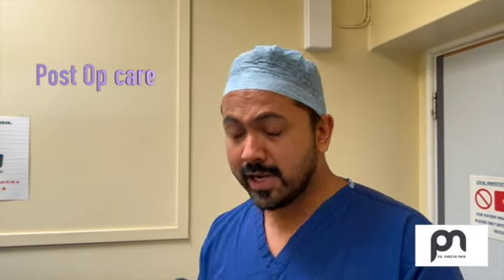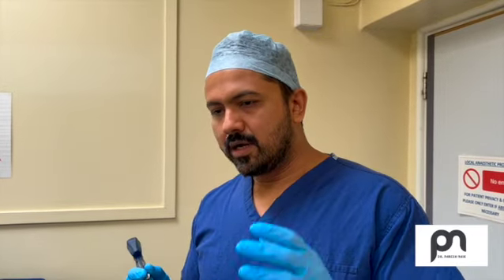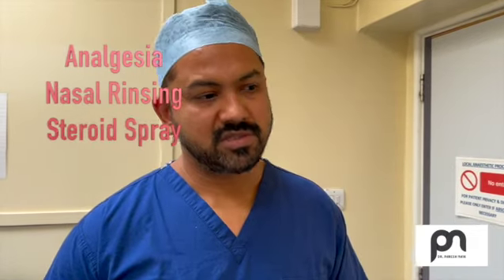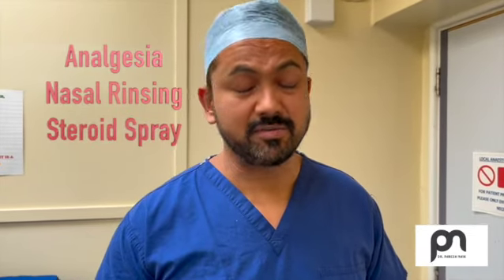Once you're done with the procedure, make sure that you have good hemostasis. Many times the probe rubs the mucosa. It's normal, okay? Don't worry about it. Don't panic, oh, it's bleeding. If you're doing it under local anesthesia, make sure the patient is aware that he or she has to spit out. If it is under general anesthesia, fantastic. You can take your own time. And if there's a lot of bleeding, you can use some hemostatic agent to control bleeding. The patient may experience pain. I would advise giving paracetamol for some time. They will stop when they feel comfortable.